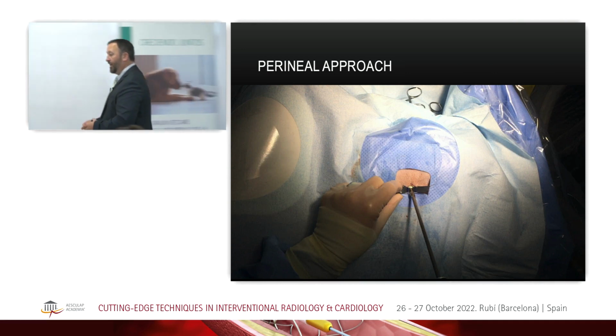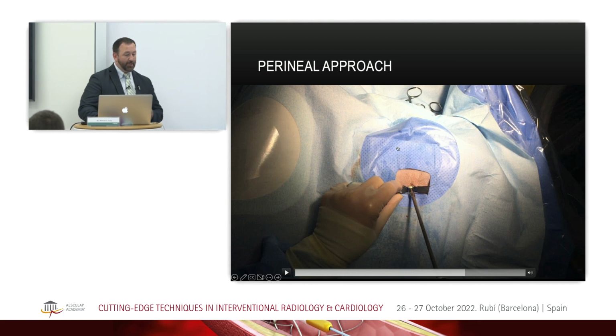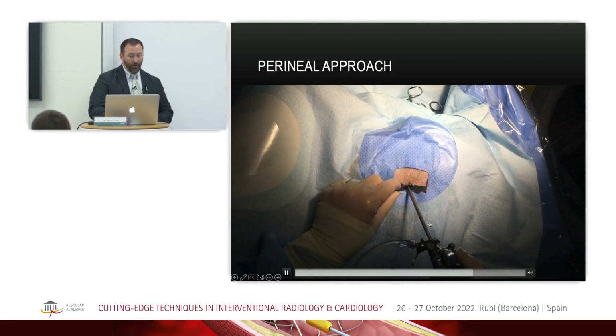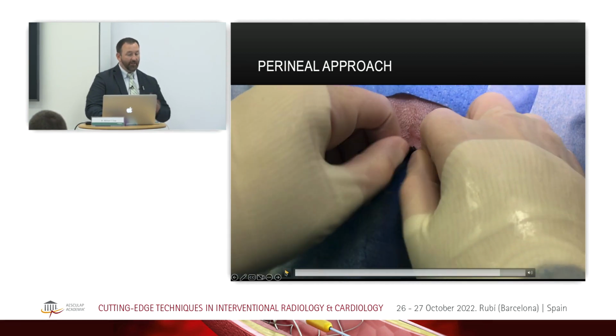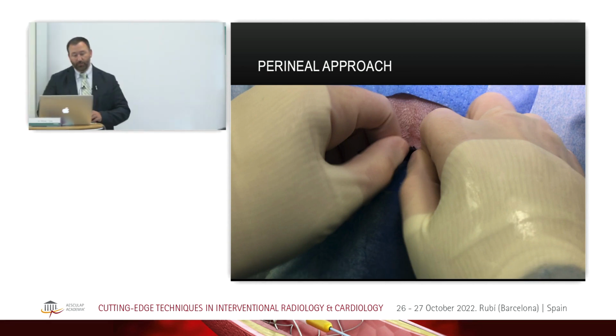So we've broken it side by side, and what it leaves us with is the sheath completely inside the pelvic urethra, but it leaves these two little wings coming out that you can actually suture down to the skin. And so you can see now we can get a large scope in there. And again, the main reason that we do this procedure is to give us access so we can use the rigid scope in a male dog as opposed to using the flexible scope.